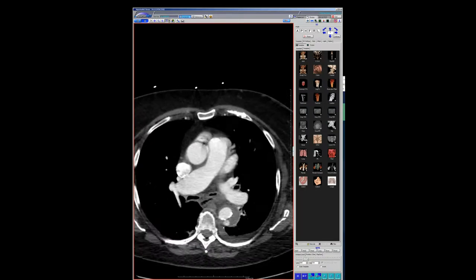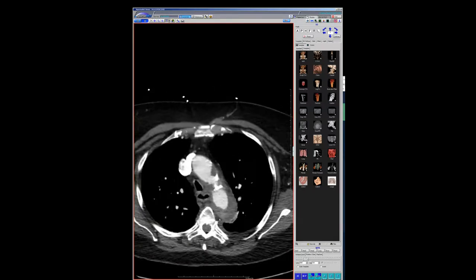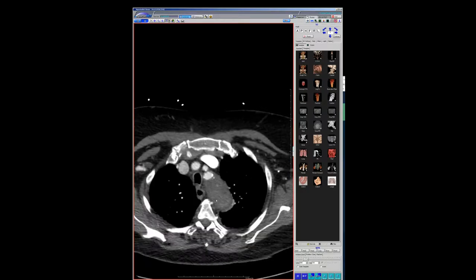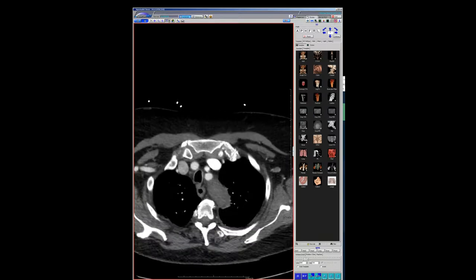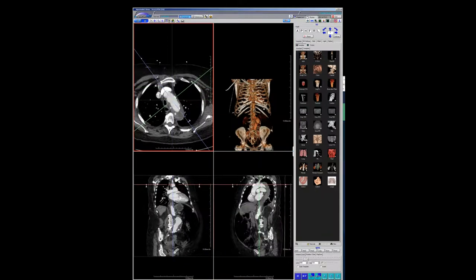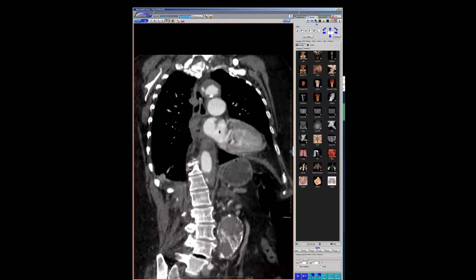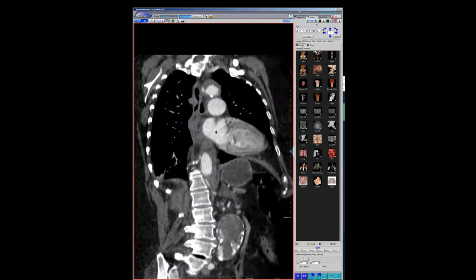Yeah, no, that's exactly. Maybe one can trace perhaps every single one of them, if you look carefully and had time, to an intercostal artery. These higher ones, you can't clearly see it. The higher ones, maybe not, maybe bronchial. Yeah, but they're definitely, you know, the patient had a couple days before and they weren't there, or they're much less conspicuous and smaller. So these are little intramural blood pools. Yep. So the bronchioles and or intercostals, but only the medial aspect pretty much of the aorta.